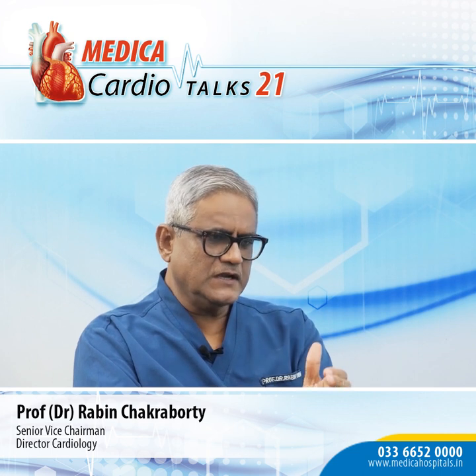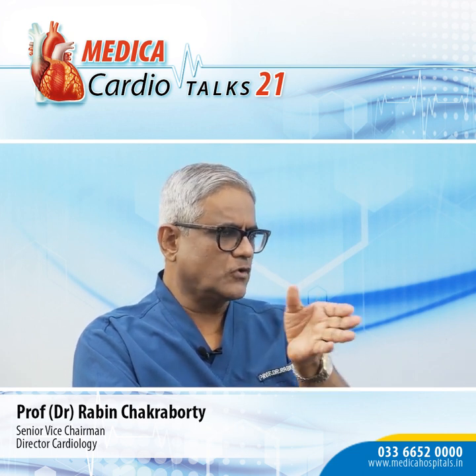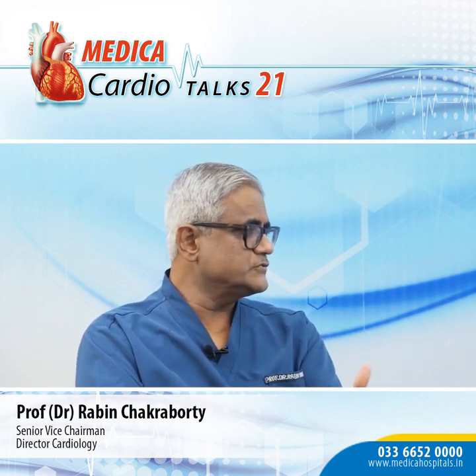The other thing is, which group of patients do you think surgery is not the right kind of procedure for? Maybe elderly individuals, or those with gross LV dysfunction, or even right ventricular dysfunction. Although right ventricular function assessment is not as simple as it appears, there has to be a volumetric analysis of the right ventricle to find out its actual pumping function. So, which group of patients will be exclusive for transcatheter tricuspid valve repair?